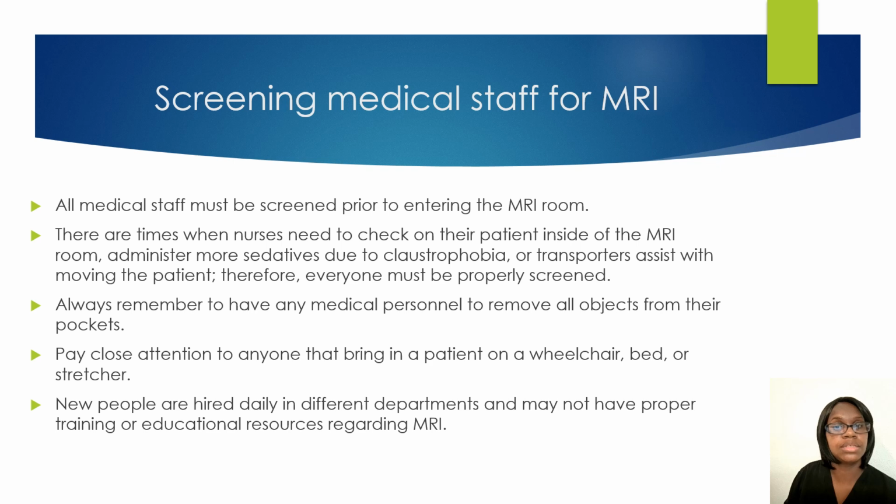For screening medical staff for MRI, all medical staff must be screened prior to entering the MRI room. That includes transporters, other MRI techs, CT techs, X-ray techs, doctors, managers, nurses, anyone who has to come inside of the MRI room, especially front desk.